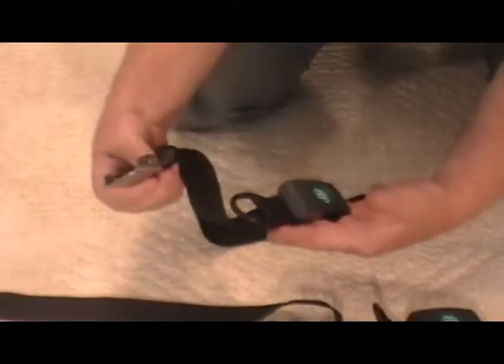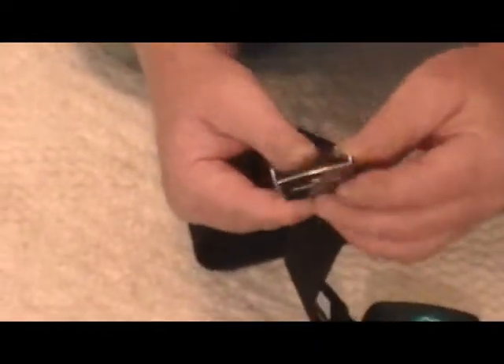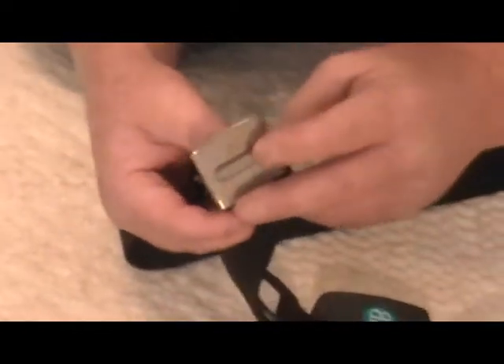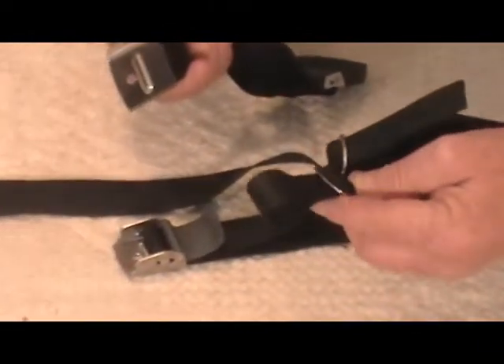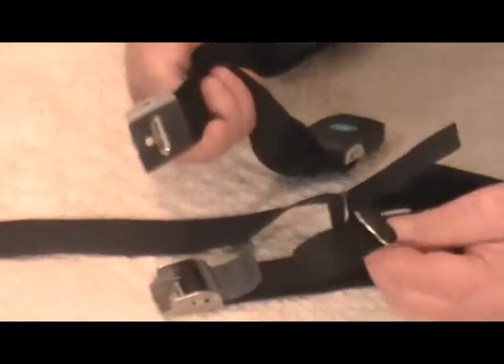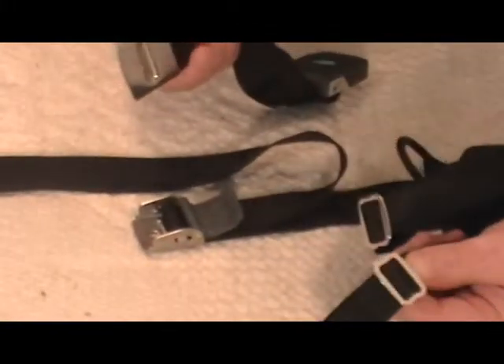The buckle of the Securiti attaches to the wheelchair via this bracket. This attaches to the aluminum back of a wheelchair. If you don't have an aluminum back or a good secure point to attach this buckle to, we can also accommodate the steel cinch buckle that will take the place of this bracket. These straps are installed on the cane itself and cinched down.